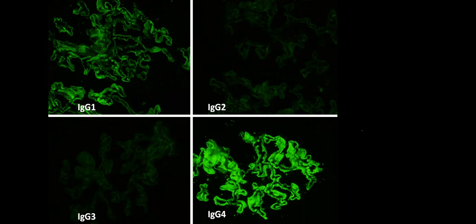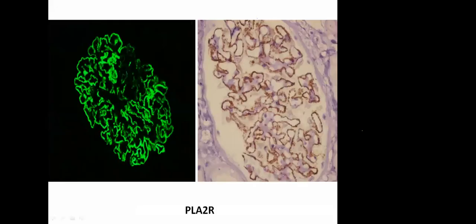Nowadays, we have IgG subclasses, we have PLA2R, we have thrombospondin, to categorize this membranous, whether it is a PLA2R associated MGN, thrombospondin associated MGN, NELL1 associated MGN, or whether it is a lupus MGN. So the important thing is, if in IgG subclasses you find dominantly IgG4 staining and less or minimal IgG1, with IgG2 and 3 negative, dominant IgG4 staining is commonly seen in primary membranous or malignancy associated MGNs. So by doing PLA2R or thrombospondin, by doing IgG subclasses, you will be able to categorize this MGN as PLA2R associated MGN.